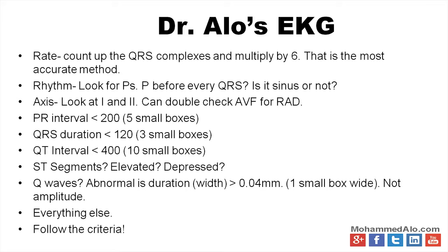Next, you look at the ST segments. Are they elevated? Are they depressed? What can we tell from that? And we'll go through a bunch of EKGs.